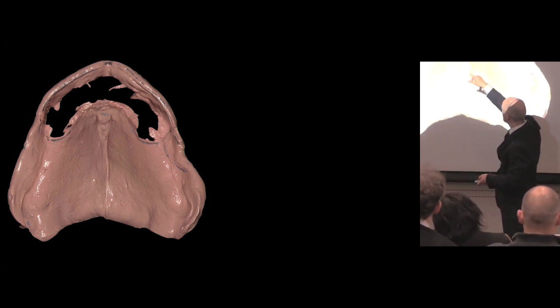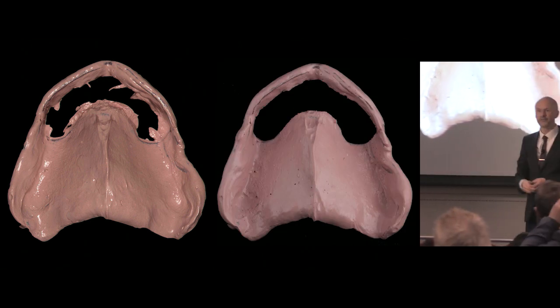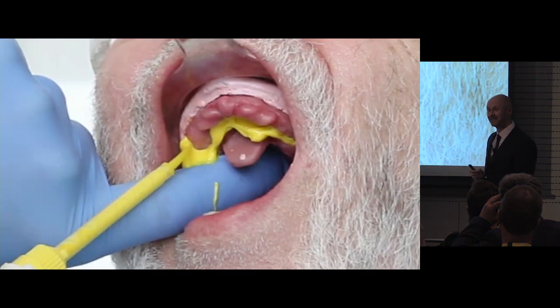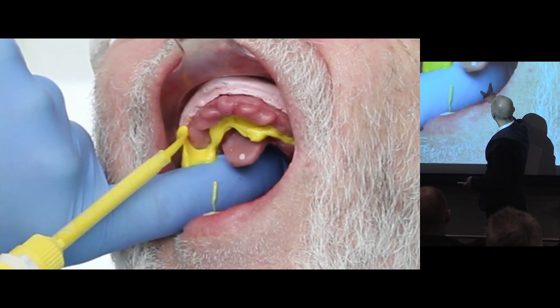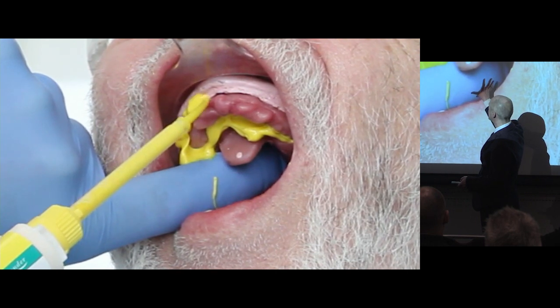So I take this out of the mouth, and then where we've got the little bit untidy edges, I just use a blade just to trim this up. And feel free to photograph anything. If you want to video the videos, go for it, it's not a problem. So that's open there. And then I put this back into the mouth. So I've got my finger on the tray very firmly, pushing it in place. So it's not moving, it's really intimately touching the tissue.